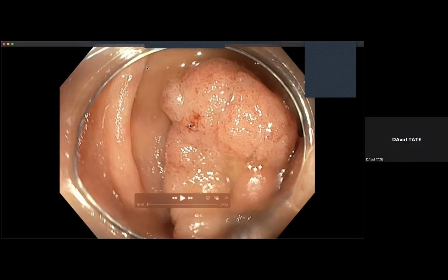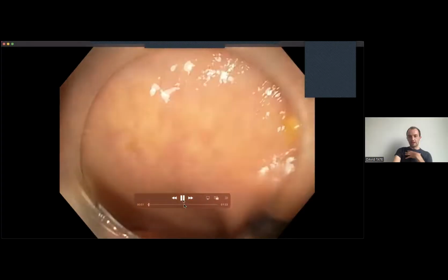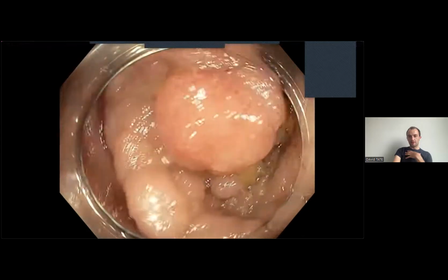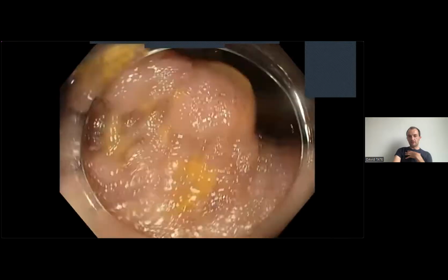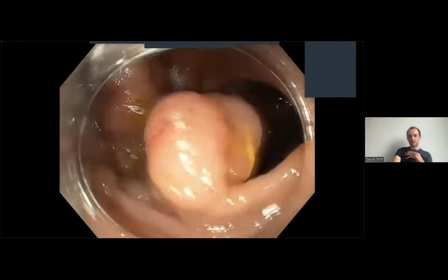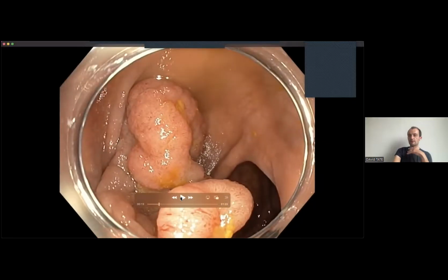Perfect. Okay, so let's have a look at this together, Mzamo, and we'll decide together what we think. First thing that you should be thinking is, what is your first impression? Is it cancer or not? So let's pause it because you've had time to make a first impression. Even if you don't think you have, your brain has already made its first impression, so you have to trust it. What do you think? Cancer or not cancer?